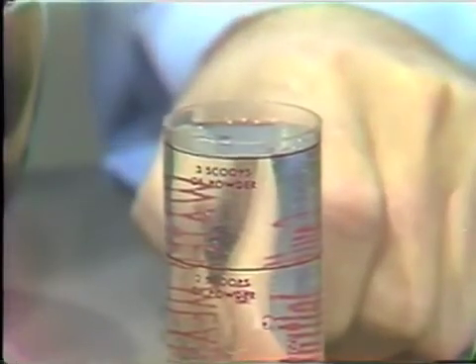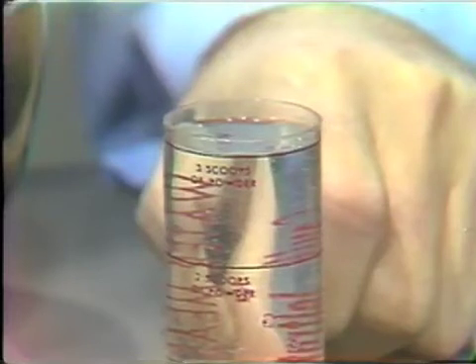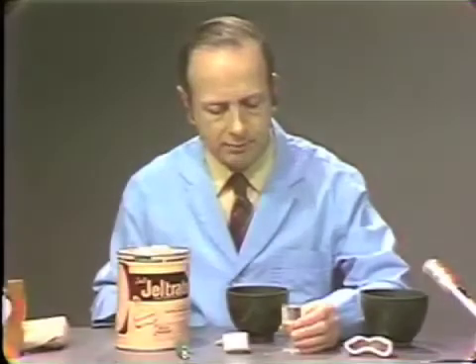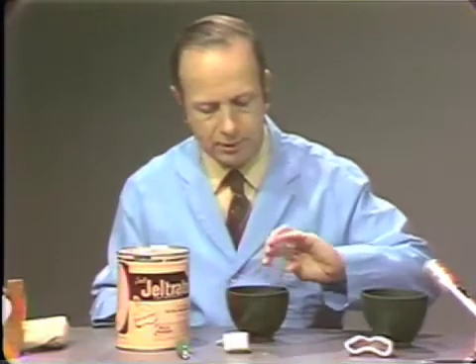The water temperature should be checked because high temperatures will accelerate the setting reaction. The temperature of the water should be about 70 degrees Fahrenheit. We take the three measures of water, the three levels, and pour this into a rubber mixing bowl.